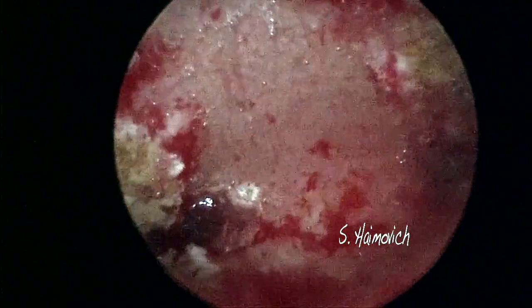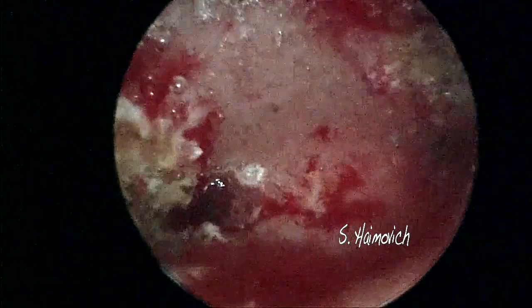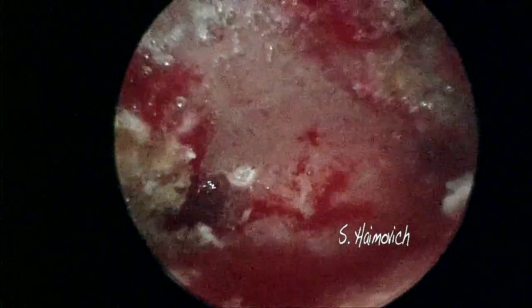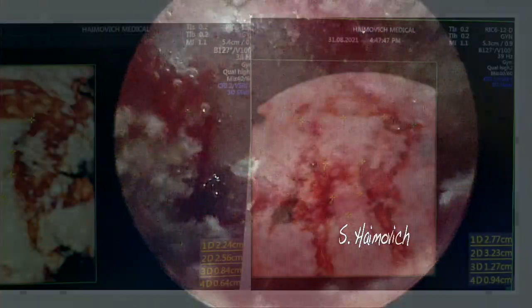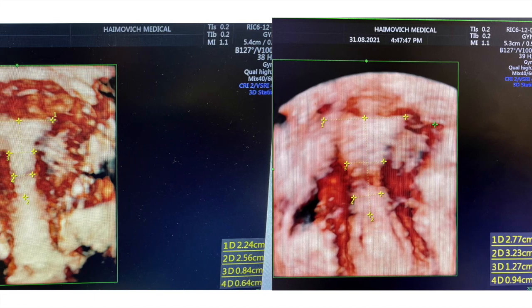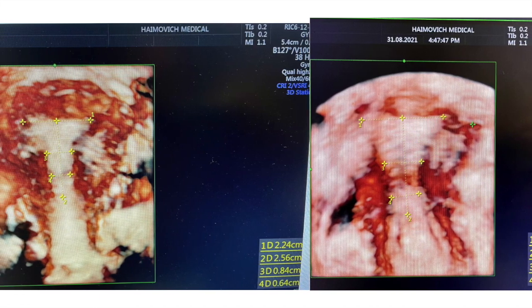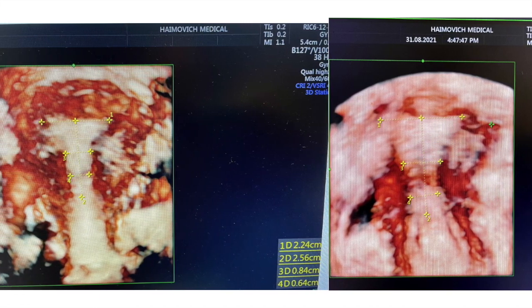It takes three months since the surgery until the uterus is ready for pregnancy. In the final 3D ultrasound image you are able to compare the cavity before and after the procedure.